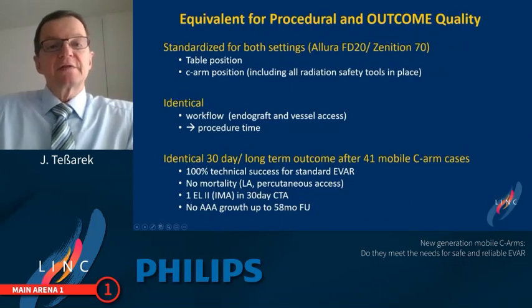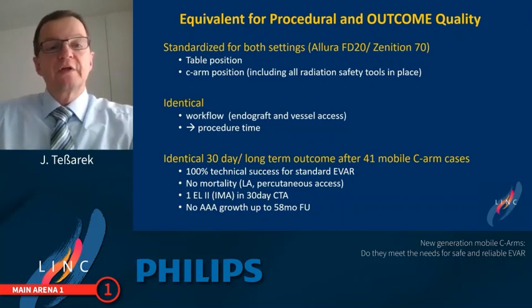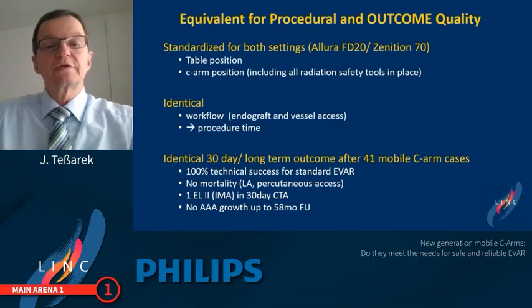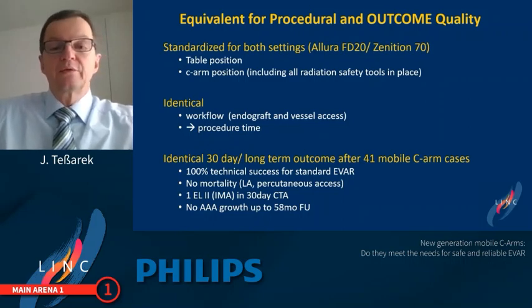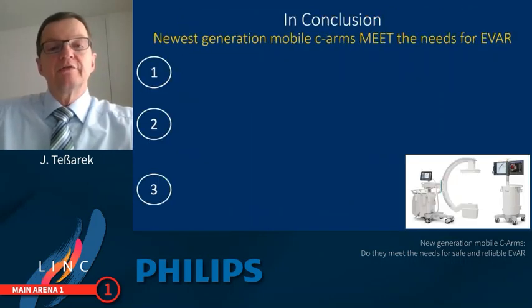So having a standardized setting, fixed C-arm position, fixed table position, including all radiation safety tools in place, you have an identical workflow. We also use the same endografts, of course, and we use the same vessel access percutaneously under local anesthesia. And in both settings, we can achieve the same procedure time, and we have an identical 30-day and long-term outcome, now comparing 41 aortic procedures done with a mobile C-arm to the standard situation with 100% technical success, no mortality, only one type 2 endoleak, and no growth with a follow-up of 58 months for our EVAR cases.